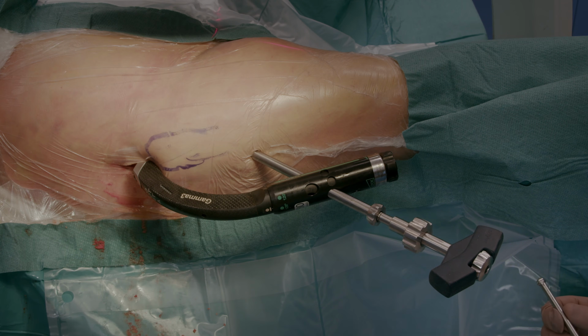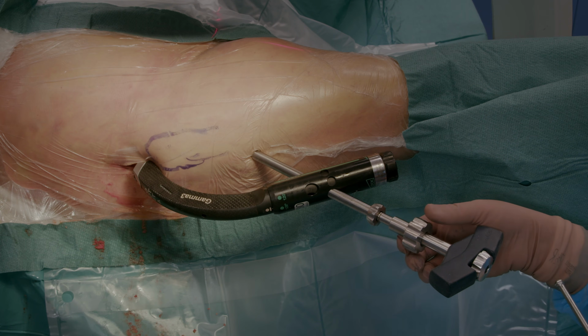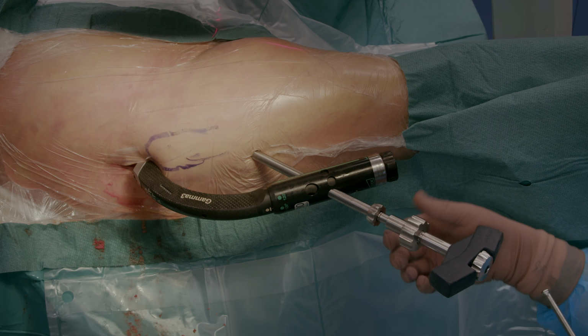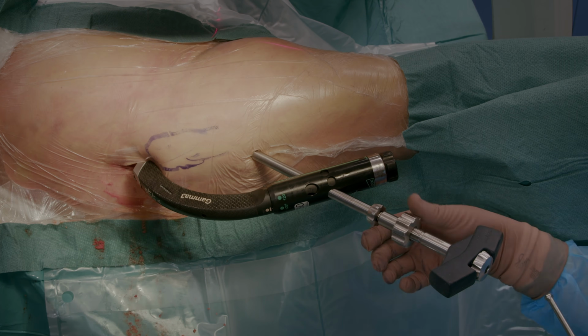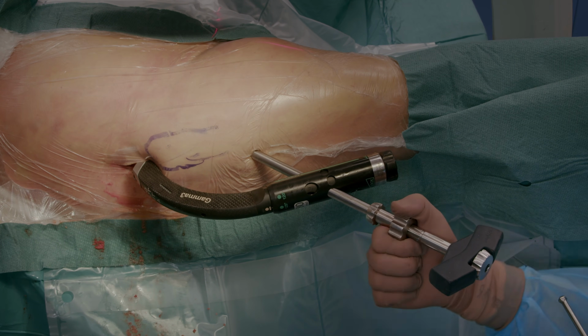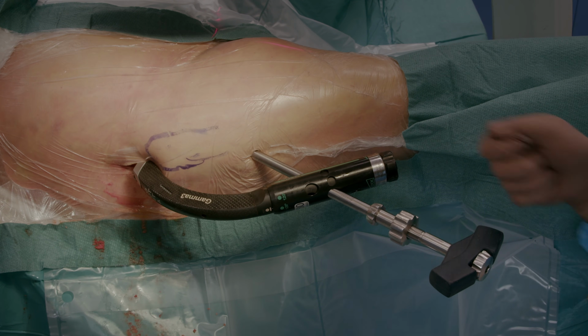Now that the screw is at the correct depth, there may still be a fracture gap, and this insertion tool can be used to compress the fracture by turning this thumb wheel on the insertion device. But you should be very careful with this if the bone is of poor quality. In such cases, the device may pull the screw off the bone instead of compressing the fracture gap.